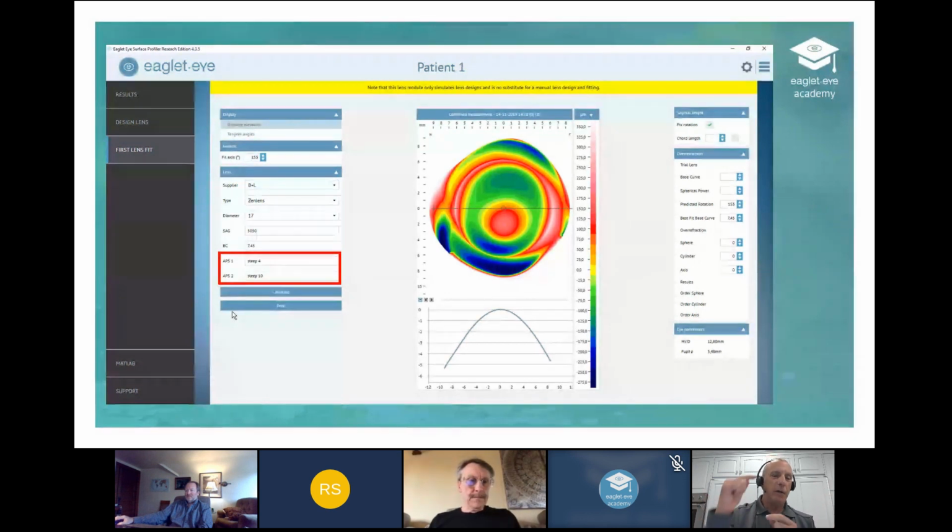And it was really, for me, and I think a lot of fitters, hard to judge what's going on in that opposite meridian. And if I didn't steepen it up, like in this case, 270 microns steep, which in the old days I never would have gone that steep, the lens would never sit down to where it really should. And you would try to keep flattening horizontally more, and it would still never come down to its right place.